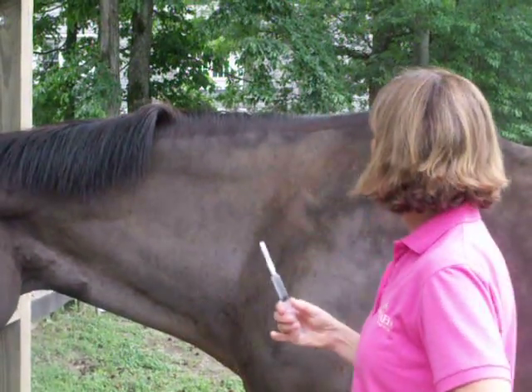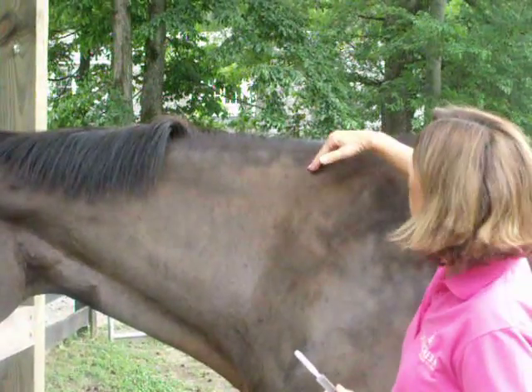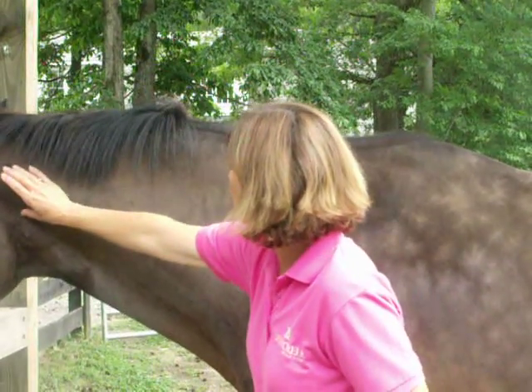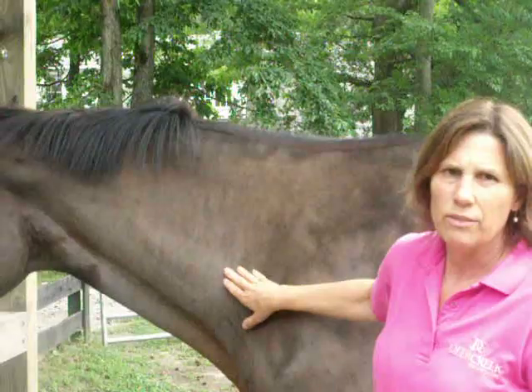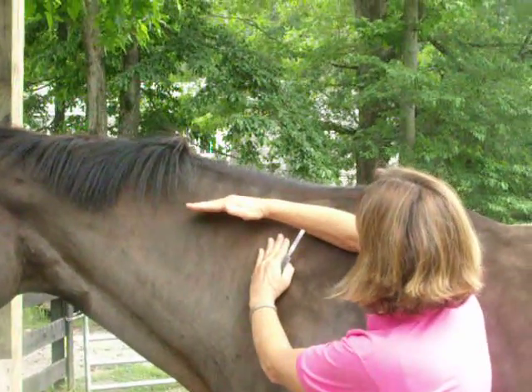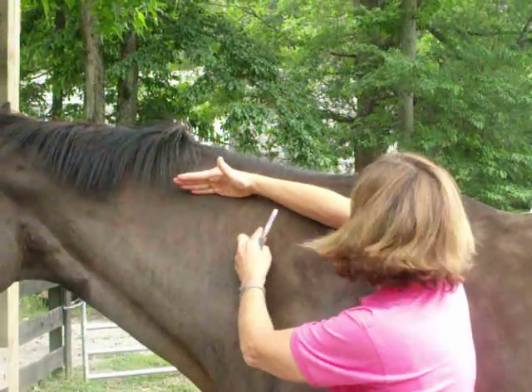The landmarks for giving an intramuscular injection are in front of the shoulder, below the crest of the neck, and above the vertebrae of the neck. It's a triangular area. You give it in the soft area of the neck.